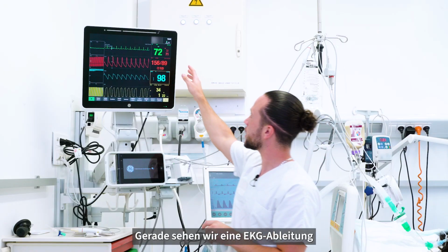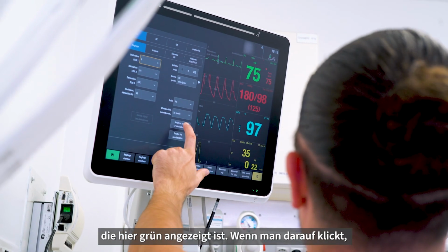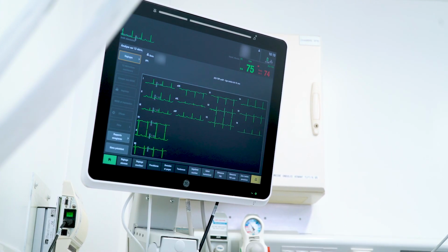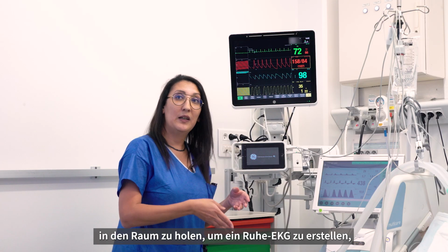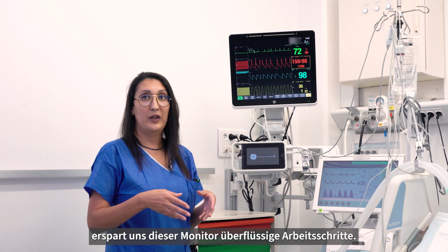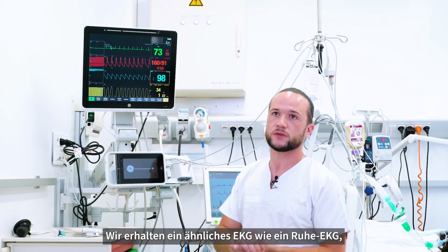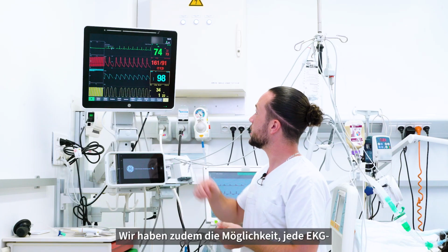We can see right now that there is an ECG signal here in green. When you click on it, you can display all 12 ECG signals. Instead of having to fetch another piece of equipment and bring it to the room to do the resting ECG, it saves us from having to do the same job twice. It's like doing an ECG with a resting ECG machine prescribed by the cardiologist.